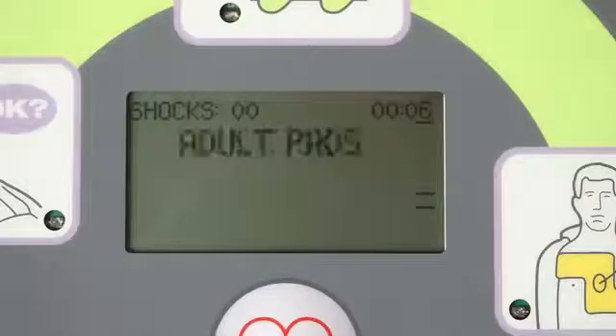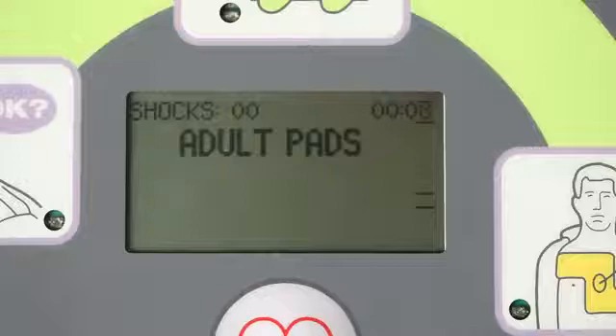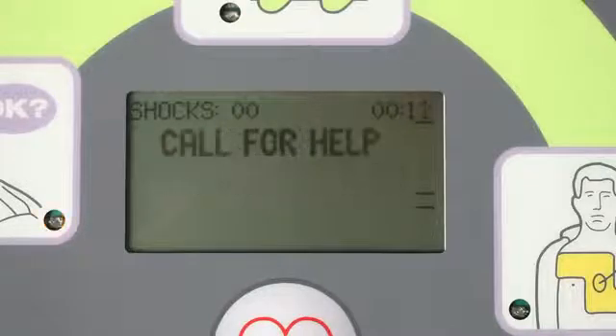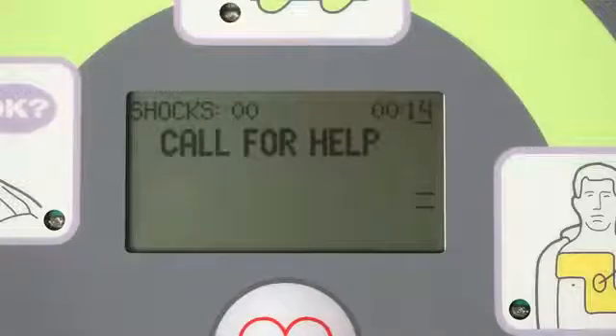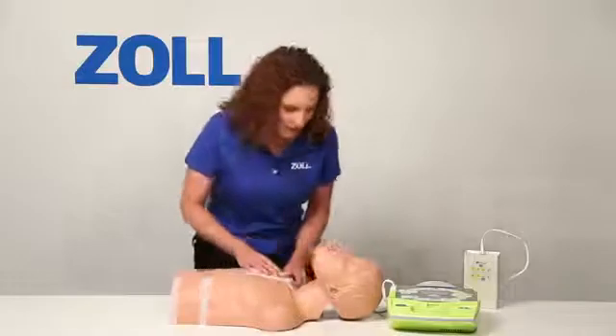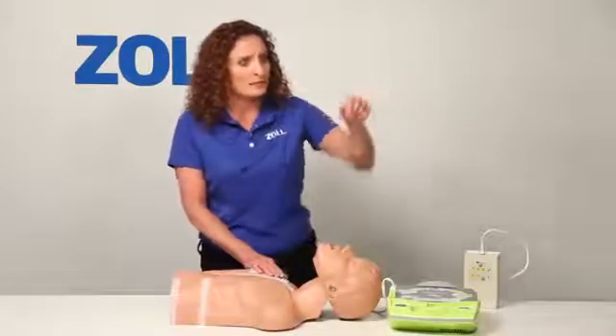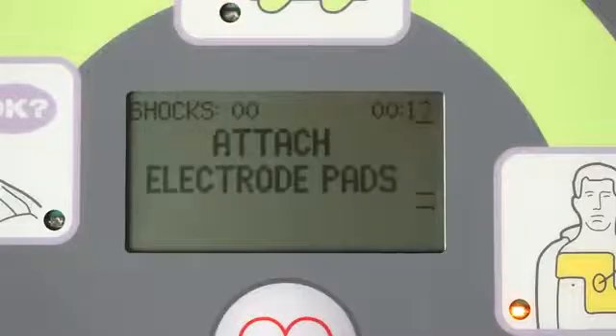Unit okay. Adult pads. Stay calm. Check responsiveness. Call for help. [Rescuer]: Are you okay? Are you okay? You — go call 911. [AED]: Attach CPR-D pads to patient's bare chest.